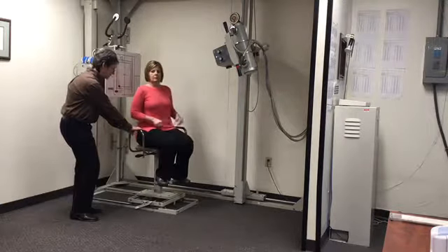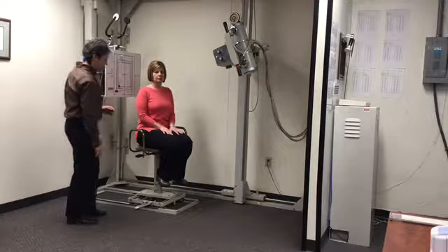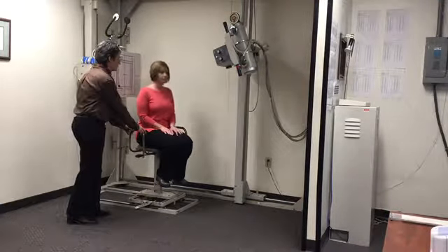Scoot your hips all the way in the back of the seat, sitting up good, straight, and tall. Make sure the shoulders are over the hip, palms in the lap, feet on the pegs, and her looking straight ahead. Okay.